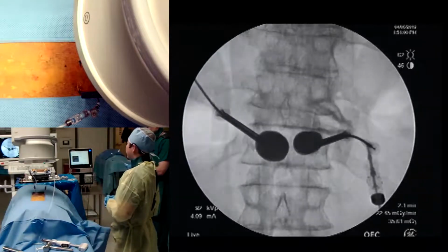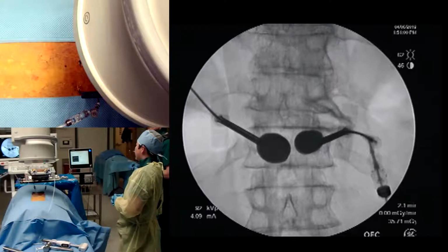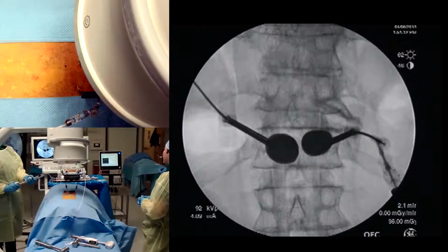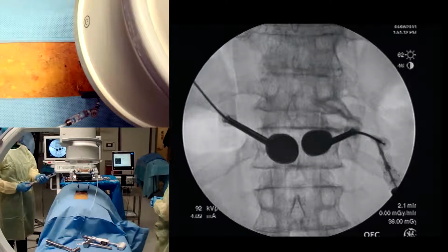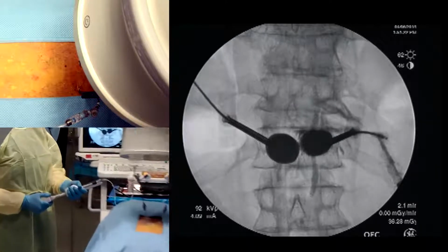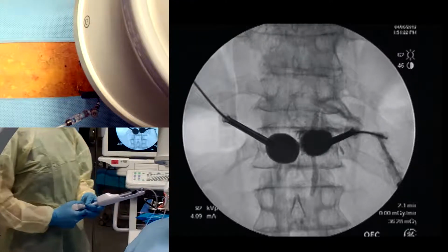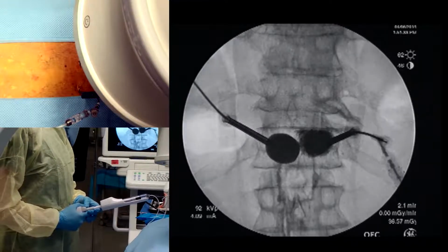Go ahead and picture that. So it looks like you can actually go a little bit more, Zane, right? Let's see a shot there. How much volume are you at right now? That's at 5. That looks pretty good. Shot there. That looks great. So we pushed the boundaries just a little bit. That's actually interesting though, right? So why don't you save that, or picture one more time? Interesting. And then go to a lateral.